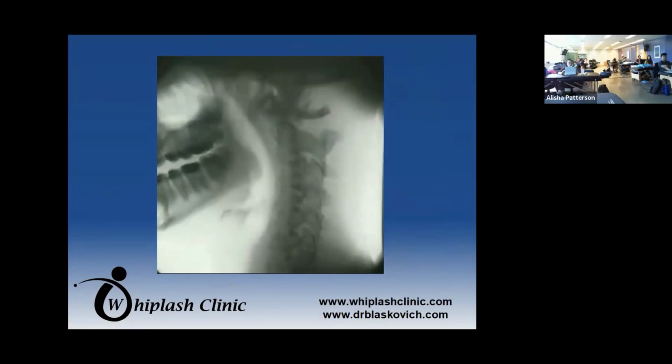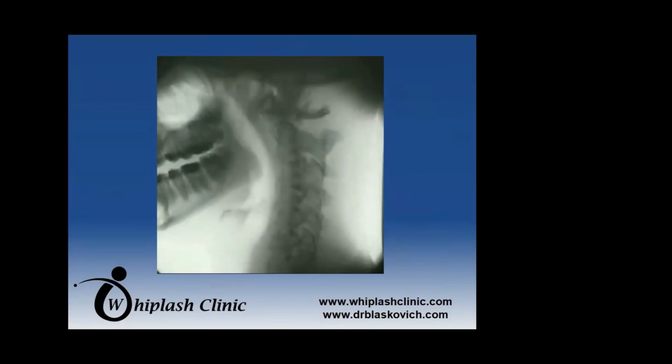So we basically have the atlas dislocating off of the axis. And that's not a normal finding. So in this case, this type of patient is a stat referral to a neurosurgeon that will hopefully take this seriously and bolt those two bones together. This is not a chiropractic or a massage patient. And there are people like that walking around. I've had no shortage of people that I've done a motion X-ray on that have shown these types of findings.